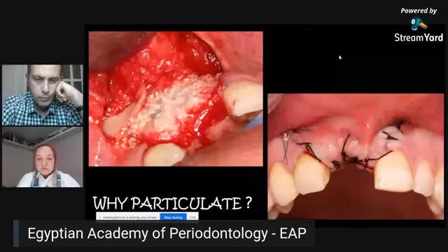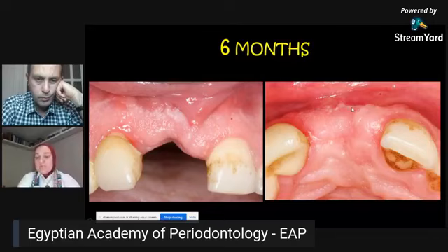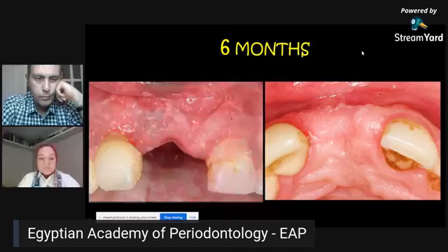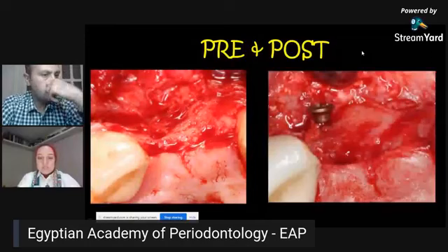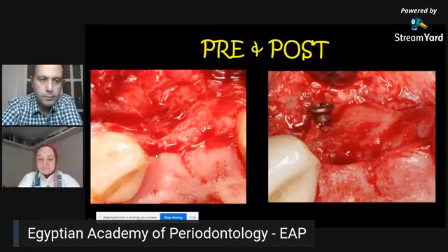After 6 months, the soft tissue looked well. There were no fenestrations or exposures. As you can see, we don't have the depression that we had before. The soft tissue looks fine. We have enough keratinized tissue and a good buccal contouring of the soft tissue and of the bone, of course. And then when you open, you can compare the pre and post situation. You can see here that this is the depression and this is the block. You have some filling here and you can compare it with the screw head. This is before and this is after.